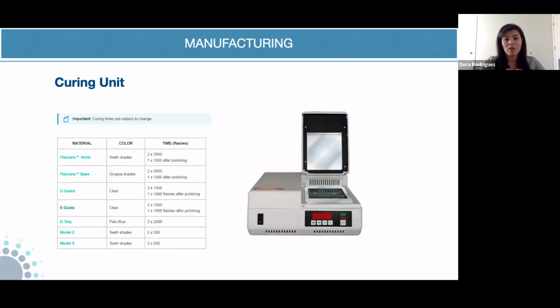So for the auto flash, there's different timings, each material has a different time for the proper cure. And one thing that I just learned that I had no clue is that not only do you have to use the proper timing, but you also have to look at that little container, that little box that comes with your auto flash, because I believe that any kind of resin nowadays can be validated for the auto flash. You have to look at that container that comes inside, because if it gets cloudy, you need to replace it. I had no idea that that was something I needed to consider, because if it gets cloudy from the other prints, the light doesn't get through that little container, the tray, and it doesn't cure your material properly. So if you're having issues with your resins, check that container, because that might be one of them.